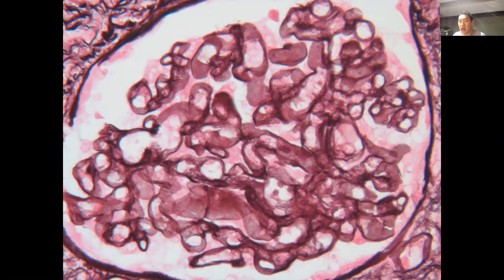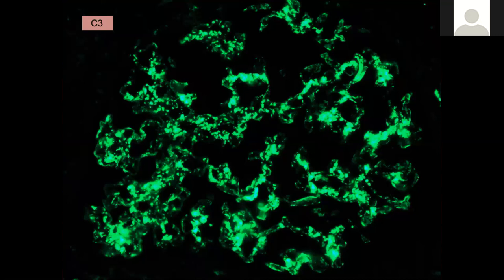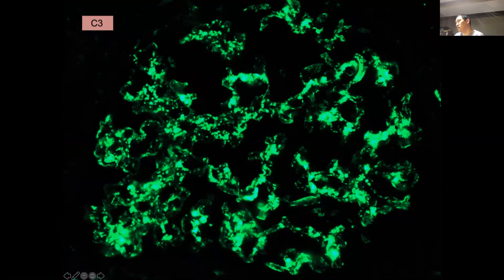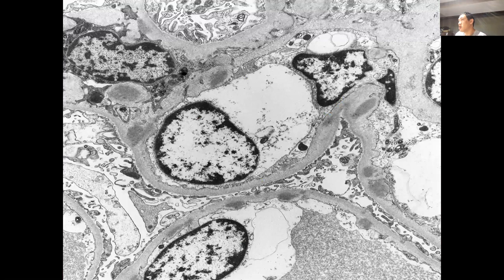Now we're moving to immunofluorescence. In classic post-infectious GN, you expect IgG, IgM, and probably C3. Here's your C3 — pretty granular staining, hard to say if it's mesangial-predominant or within the loops, but certainly some of it is in the periphery within capillary loops. This was positive for C3 and IgG. IgA was negative. Now let's move to EM and look for deposits.